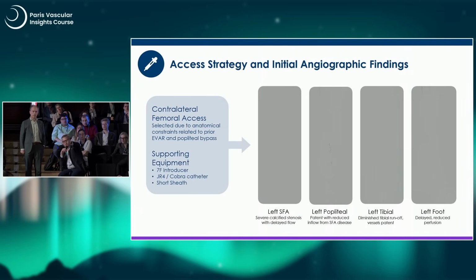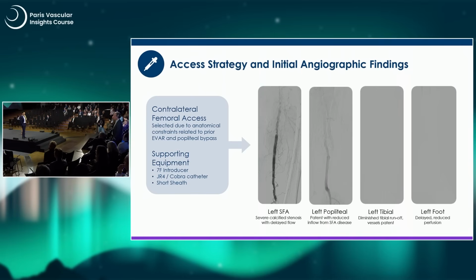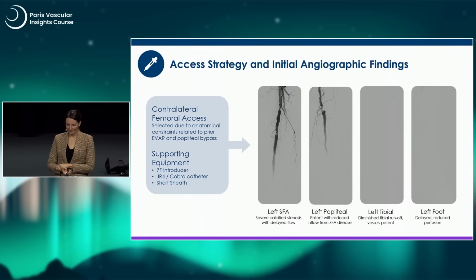there's one thing to notice. Go to the second angiogram. Could you play left popliteal? Yeah, right here. So when it's going slow, you see at the end of the picture at the top of the lesion, it looks like nodular calcium, these circular round balls. Let me just point this out.